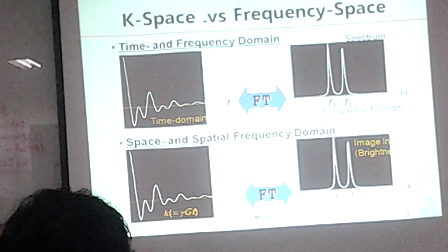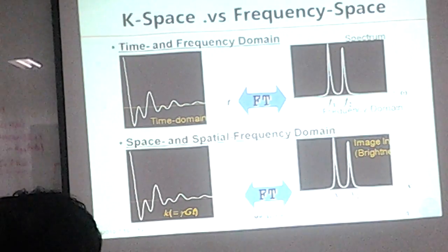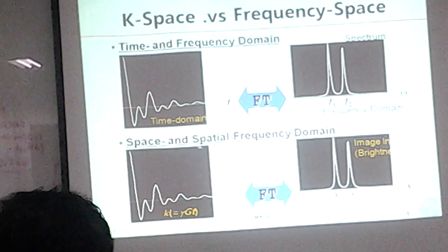If we assume that this is the image data, then the inverse transformed data, or MR data domain, is called spatial frequency domain data or K-space data.